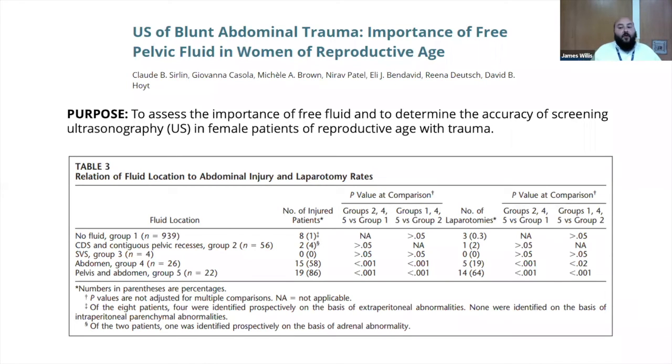Patients were assigned to 5 groups on the basis of the presence and location of the intra-abdominal fluid, whether there was no intraperitoneal fluid, whether the fluid was only in the cul-de-sac, whether the fluid was immediately superior to the bladder in the pelvic view, or whether the fluid was outside of the pelvic view, also throughout the whole abdomen. They compared the ultrasound results to the clinical outcome and the use of CT, repeat ultrasounds, the cystographic evidence, DPL, surgical and/or autopsy findings.